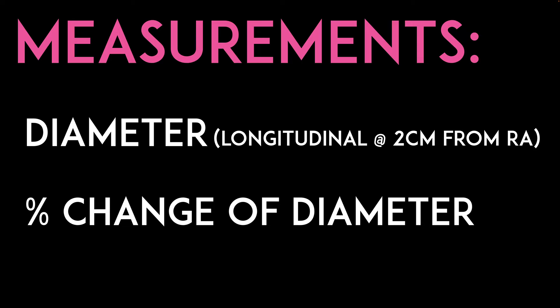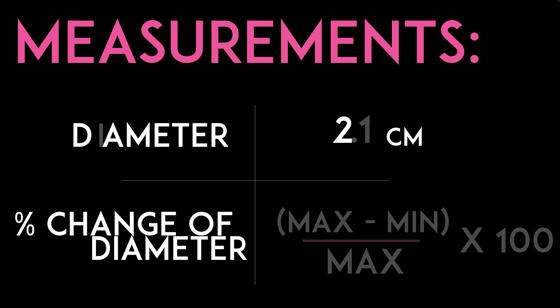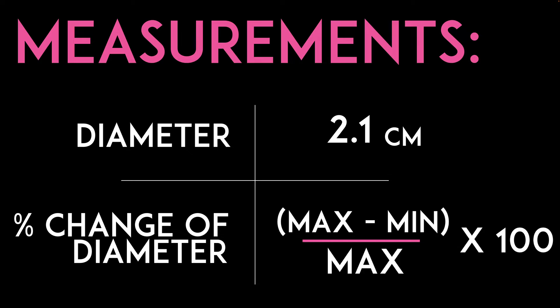Most of the time I just eyeball it to say if it's high or low, but you can measure the actual numbers. The typical way it is reported — especially in the cardiology literature — is a diameter less than 2.1 centimeters or greater than or equal to 2.1 centimeters, and then the percent change or collapse is: max minus minimum over maximum times 100. This is the most common formula, but make sure whatever study you're reading uses this same one, as there are two different ways some studies measure it.